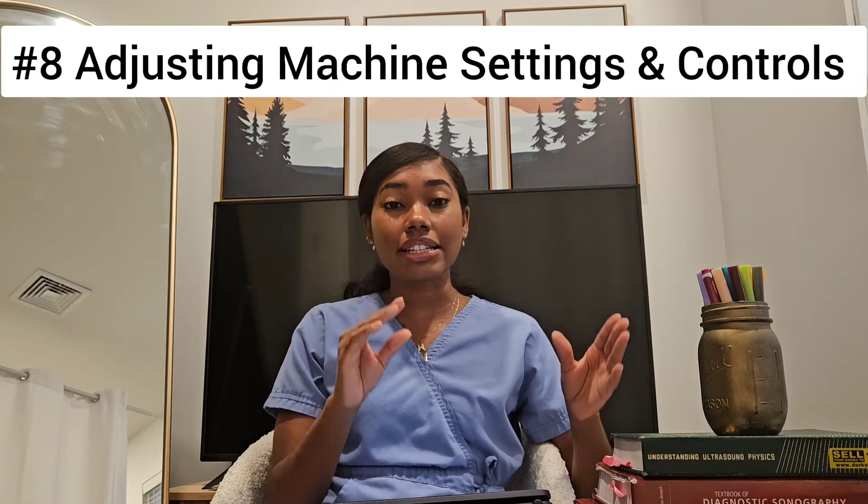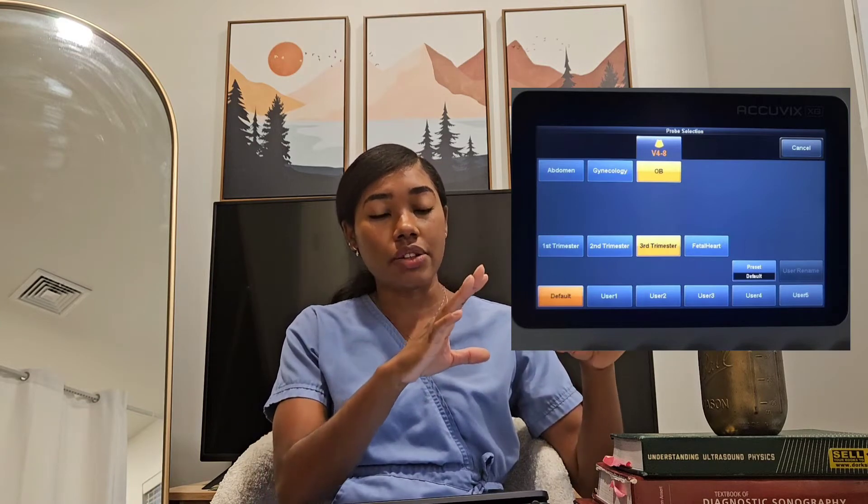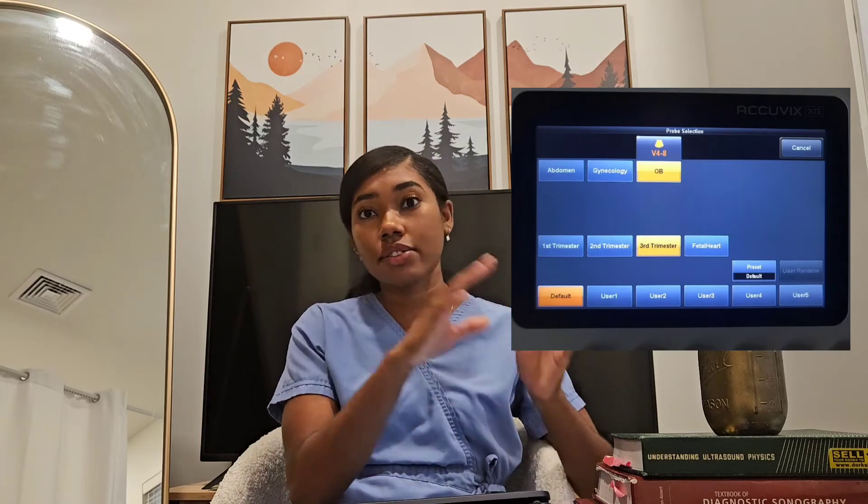On the machine for each exam, make sure you are selecting the correct exam preset. For each type of exam, the machines come programmed with different presets. If you have the wrong preset, your images will not look as high quality as they could. For a renal exam, choose a renal preset. For a GYN exam, select a GYN preset — don't have it on OB when you're scanning GYN. That can alter your image and make it look a little funny.